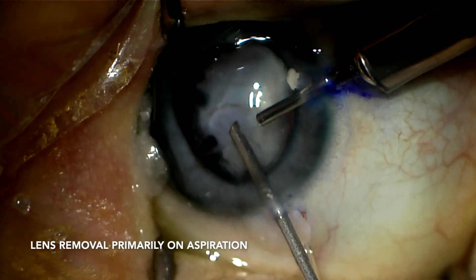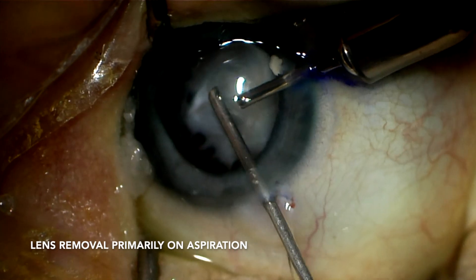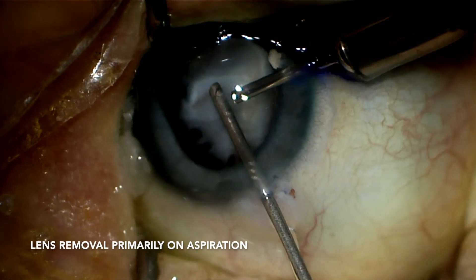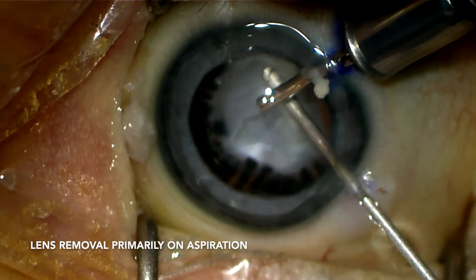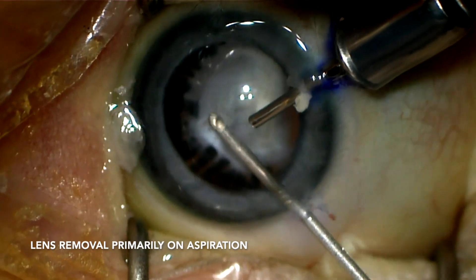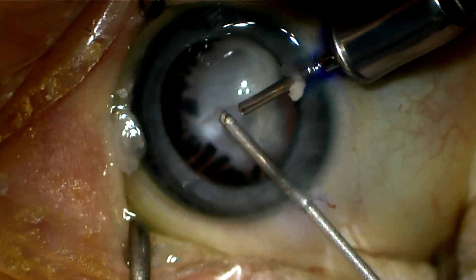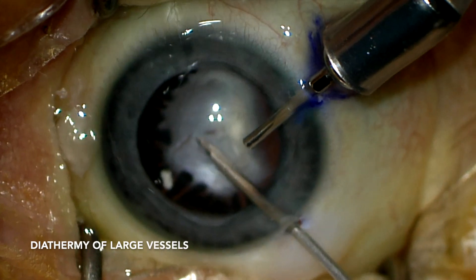You can see here that there are elongated ciliary processes, as well as iris vessels. Once the lens is removed, it is found that there is a large membrane posterior to the lens with a lot of prominent vessels.